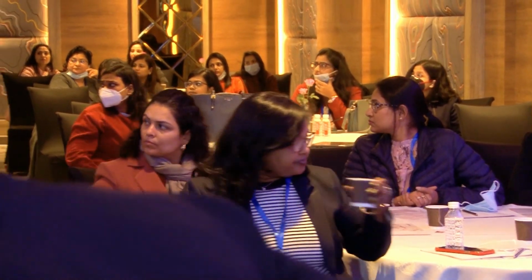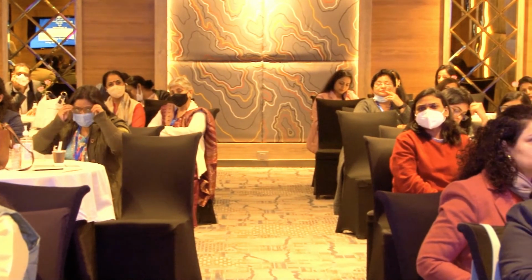Just one more question. Shall I ask? Yes, please go ahead. It's slightly deviating from this topic, but have you had any experience regarding the appearance of NRBCs just before an increased mortality of the patient? Oh, yes. Of course. It is very, very significant. A very important question. In fact, there is a publication which has said that in patients who are in intensive care, appearance of NRBCs can indicate mortality. But please remember, these are all done on samples which are within 4 hours of sample collection.